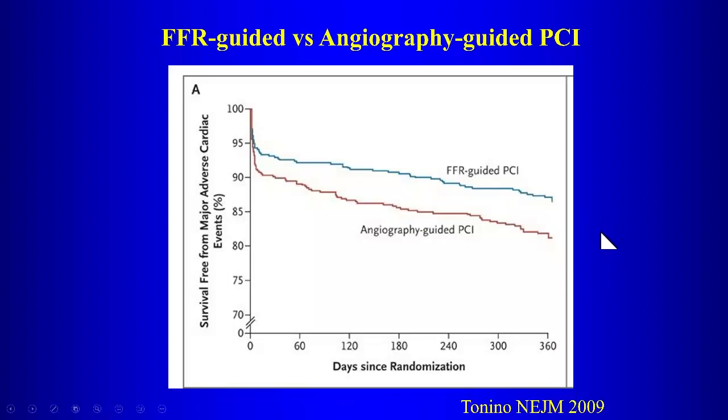You have a question? Yeah, so does that mean in the FFR guided group, they did invasive FFR?